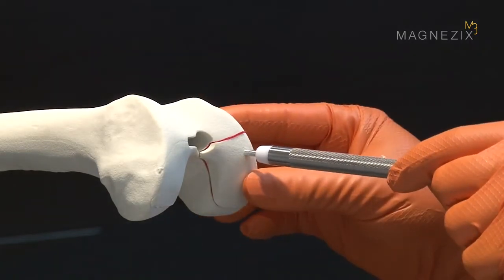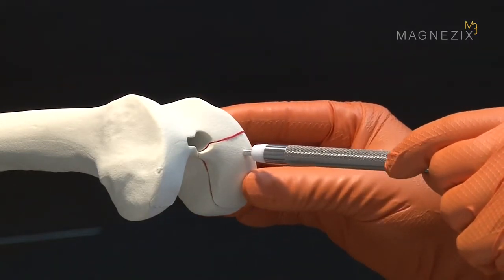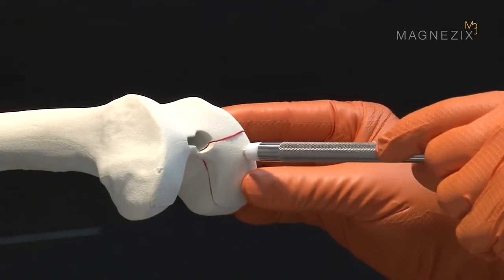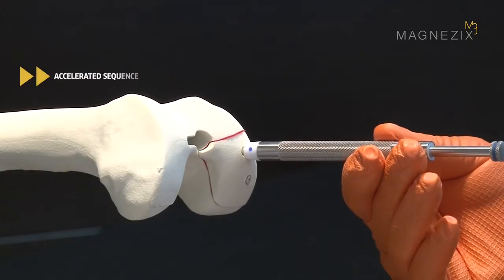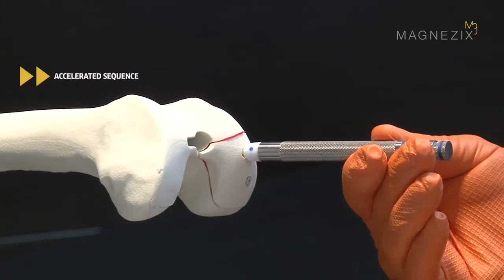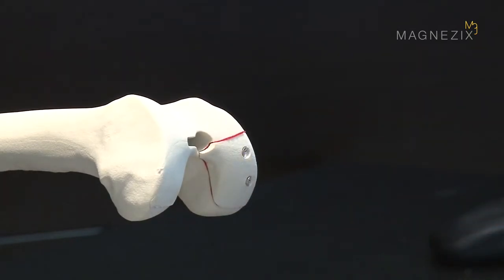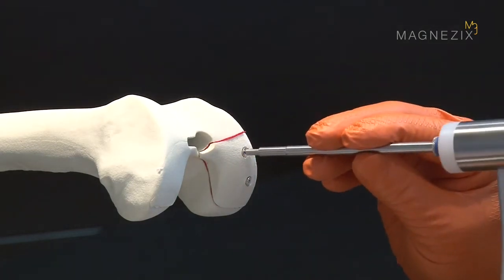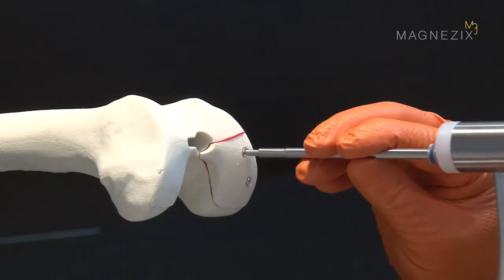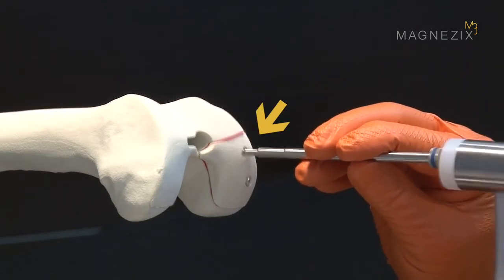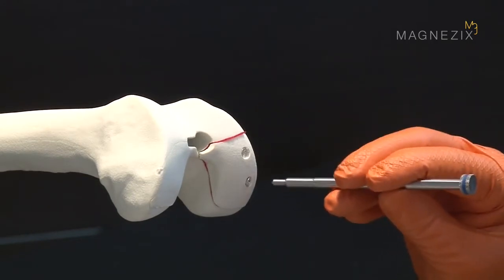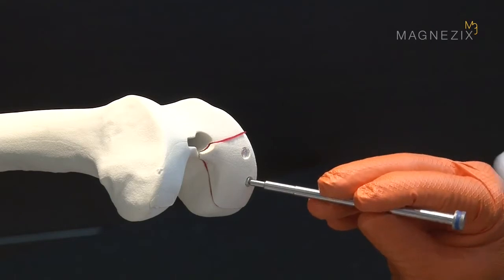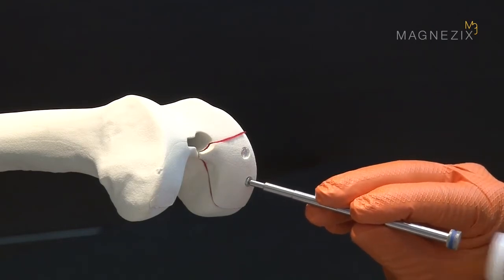The impactor sleeve protects long pins in particular against bending. We therefore recommend that you use the impactor. In some cases, the pin has to be countersunk. The impactor insert is used for this. The recess in the head of the pin helps position the insert centrally and reduces the risk of the insert slipping off the pin head.